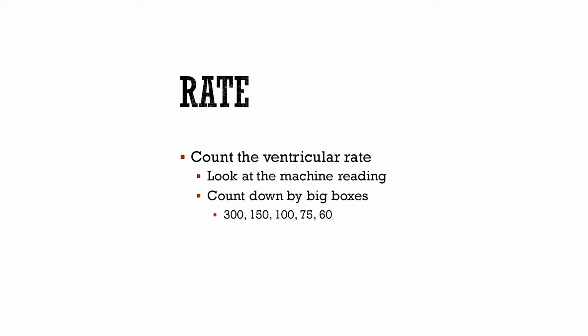So starting with the rate, you're going to count the ventricular rate. This is one of the very few things that you can look at the machine read for. It'll tell you at the top. If there's no machine read on the ventricular rate for some reason, I like to count down by looking at the big boxes.